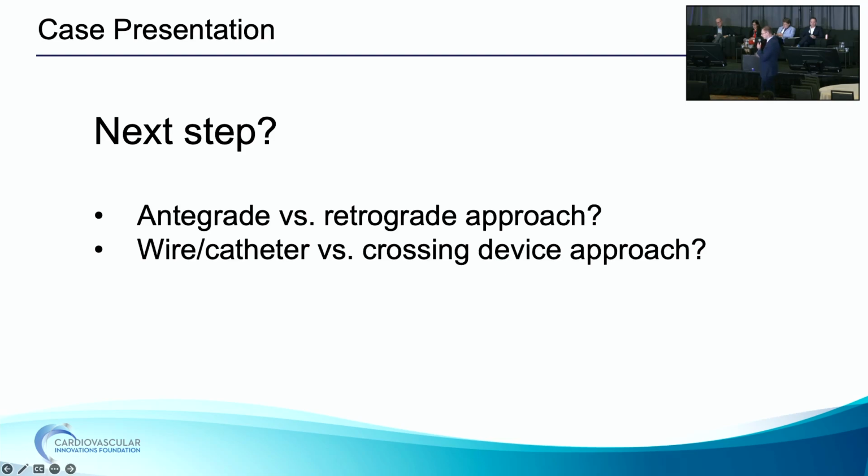So I'll ask the panel to comment what the next steps would be. There's a few options here: antegrade, retrograde approach, simple wire catheter technique, crossing device, dedicated CTO device approach, and we'll go from there.